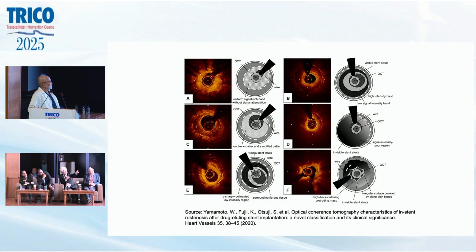But F might be some nodular calcification. Therefore, we need an ablation, or it depends on another condition. But IVL should be very useful. But first of all, I don't know. I know that the restenosis with stent is high.